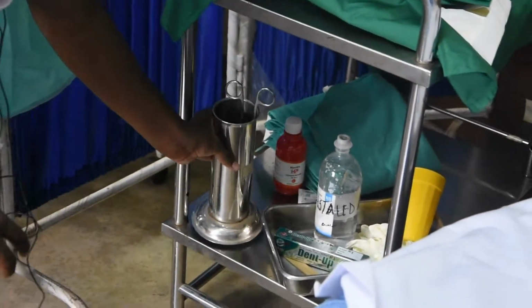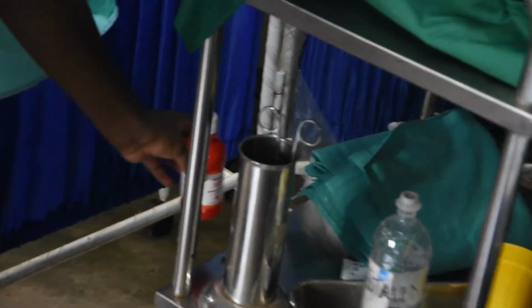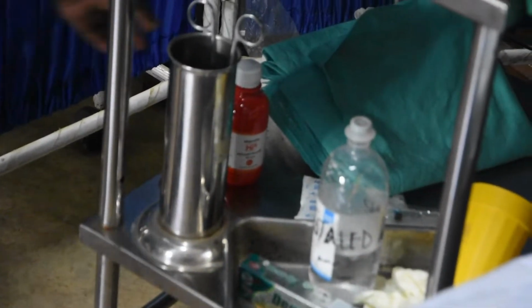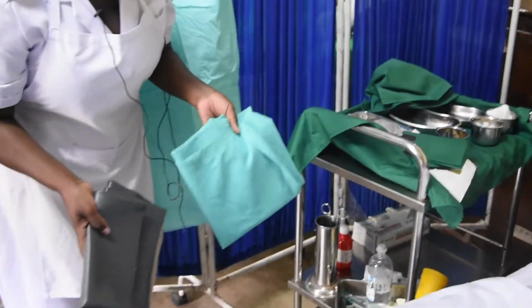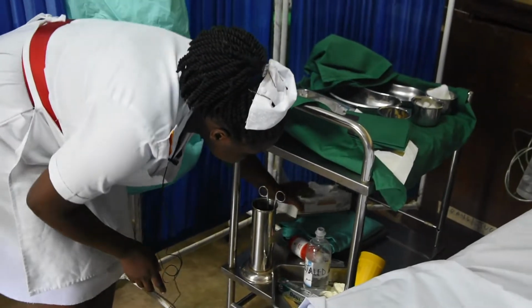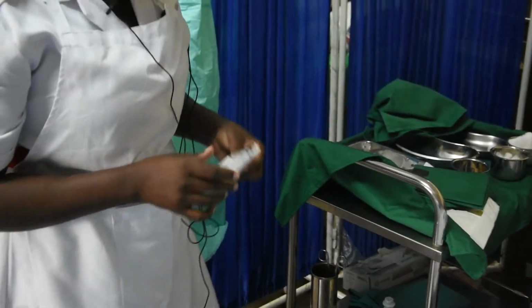We shall need hydrogen peroxide, where we shall immerse our used tracheostomy tube. We shall need a tray containing equipment for oral care. Then we shall need a Macintosh and a towel to protect the patient's linen, a pair of clean gloves for the assistant, and lastly, we shall need 5 ml syringes.